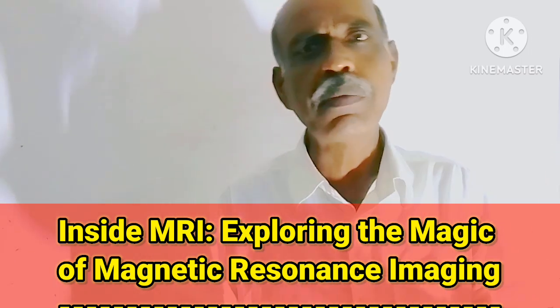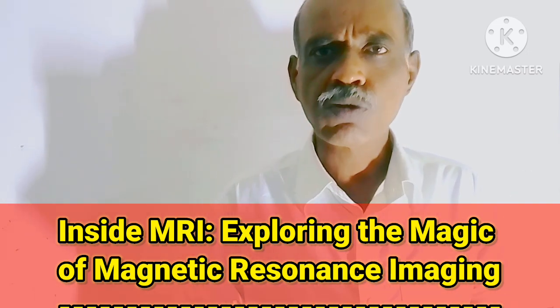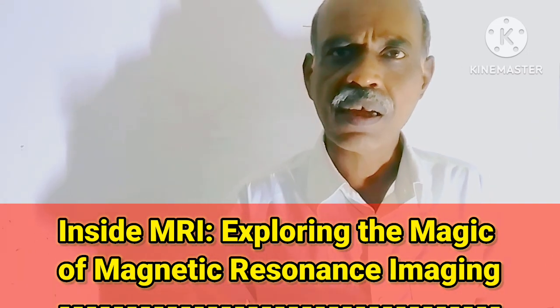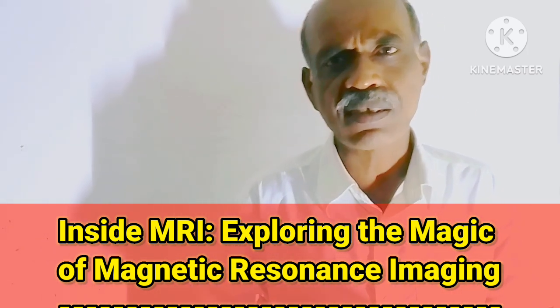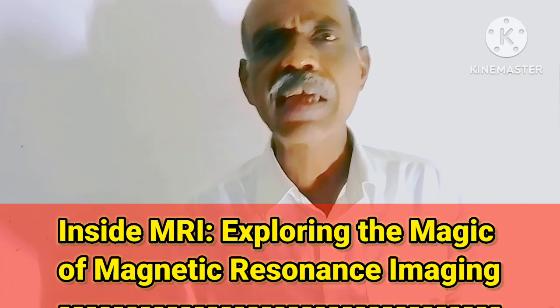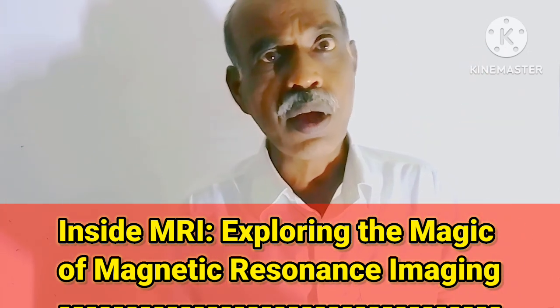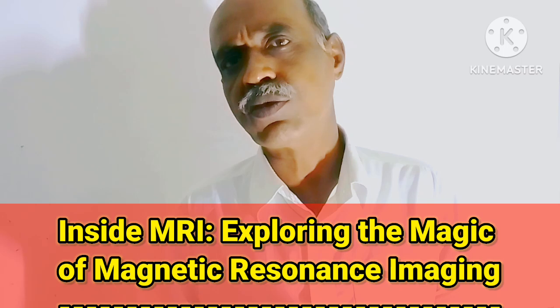This is nothing but an imaging machine. X-rays are used to take images. Again, CT scans are there. The purpose is the same, to take images. But in the case of X-rays and CT scans, radiations are used, such as ionizing radiation in X-rays and CT scans. But in the case of MRI, no radiation is used.